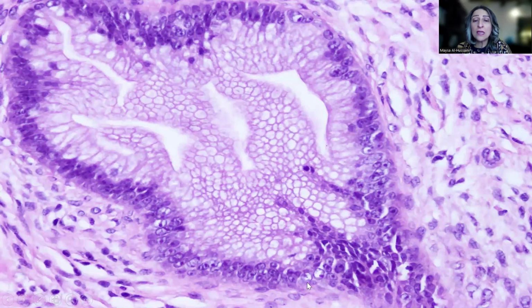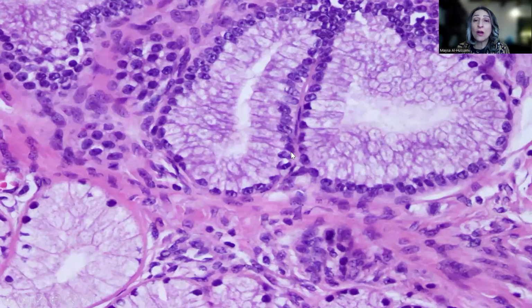Now, sometimes in some of the glands, you might start to see some degree of pleomorphism and some prominent nucleoli. This does not negate the diagnosis. Still, the case would be signed out the same, as a gastric-type adenocarcinoma.